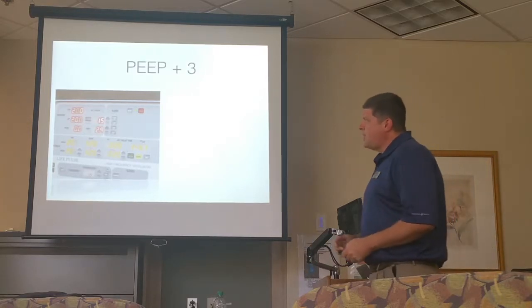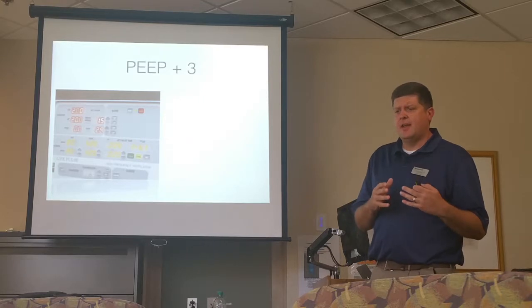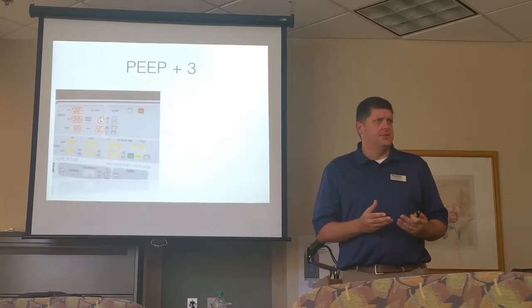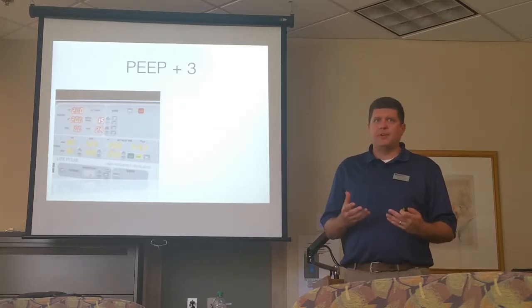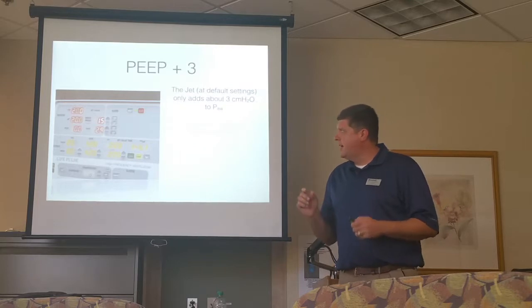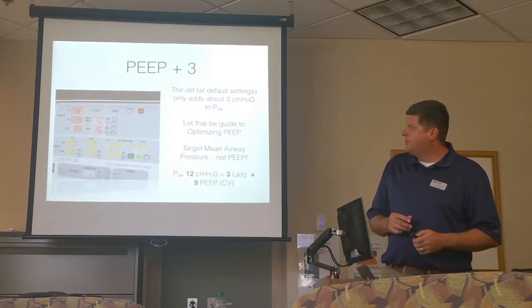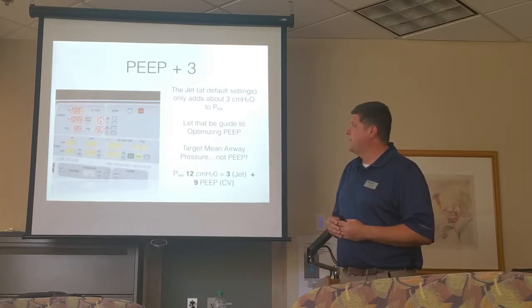Okay. So when we talk about optimizing PEEP and how much is too much and things like that, it's always a good idea to concentrate on the mean airway pressure. PEEP is just your primary way to get mean airway pressure, but mean is always the bigger picture that we should always look at, okay? And so here's a really nice rule of thumb that I've used for plus 20 years now.